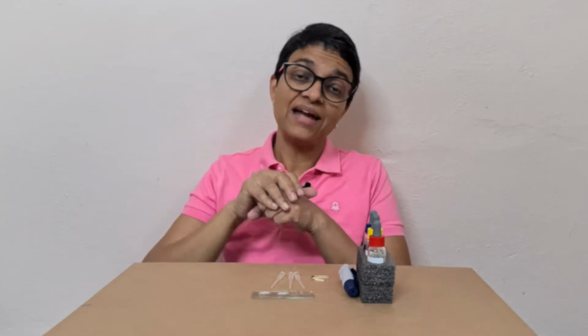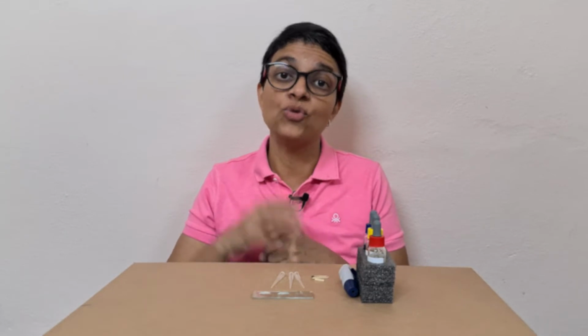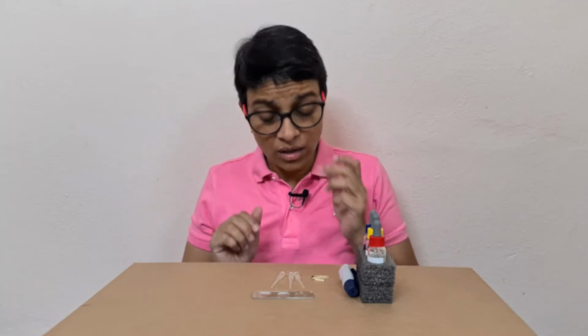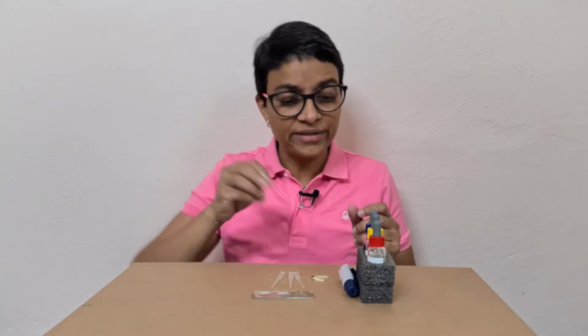Presence of A antigen, A group. Presence of B antigen on your RBC, you are B group. Presence of AB antigen on the RBC makes you AB, and absence of any antigen makes you O. So that's how it is done. I'll show you about the inheritance in a minute while we are doing the experiment.